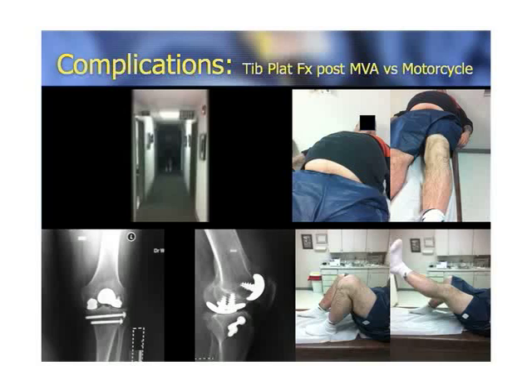But one of the things that I always worried about, and I think what's nice with the options that you have in this system, is that when you're addressing the patellofemoral joint, with your first step with your guide, as you reference off of the trochlear notch, if your footprint on the guide goes over the top of the cartilage and hits the anterior cortex when you're using the wave, I drop down to the classic because I'm always worried about taking that amount of bone. In this case we avoided that. But if in that first step I ever see that, I always drop down to the classic just to avoid taking bone that may hit that anterior cortex, which would cause a stress riser. In this case, these implants did not appear to be the weak link in that injury, which to me was very interesting.